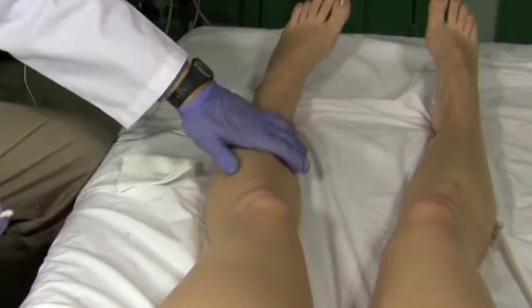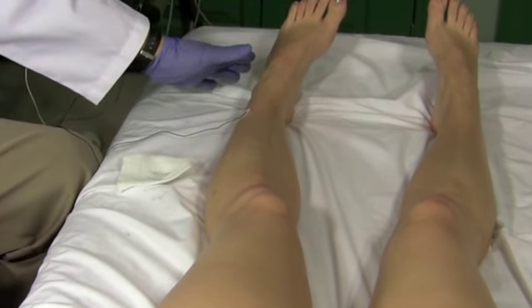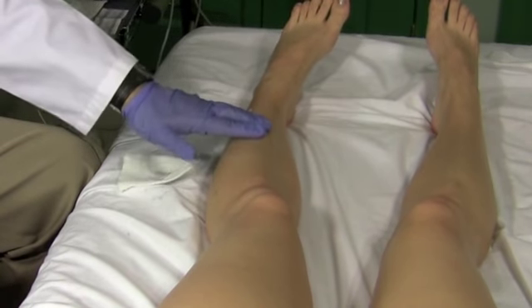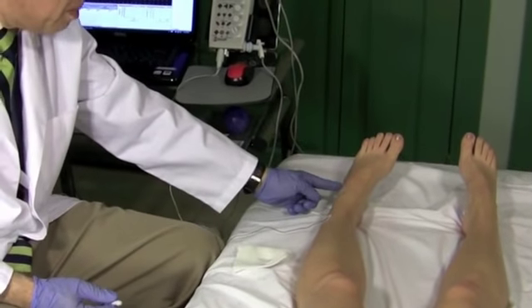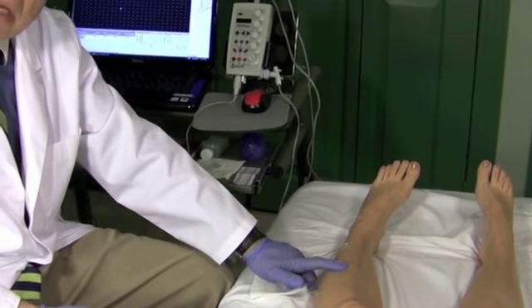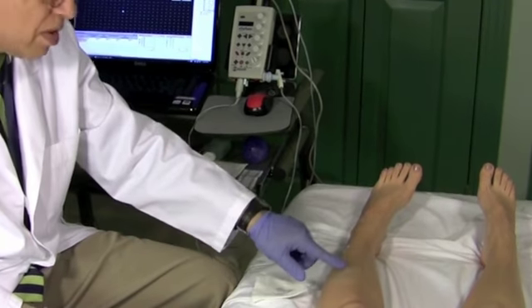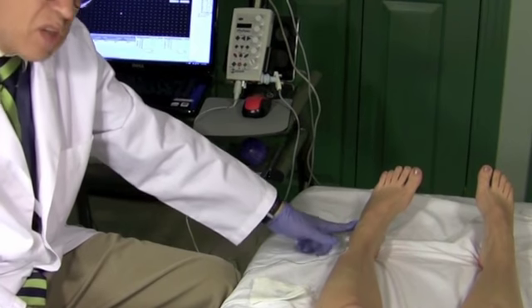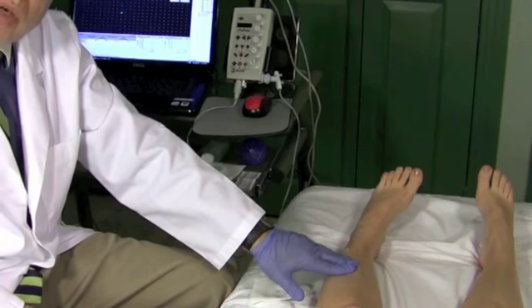So now here again is where we're going with trying to find out different muscles, different nerves, same root level, different root levels, same nerve. For instance, if you have a peroneal nerve lesion, the EDB and the tibialis anterior will be involved, okay? And because it's a peroneal nerve lesion, even though this is L4 primarily, this is L5 and S1. So it could either be a peroneal nerve lesion or L4, L5, S1, which is less likely.